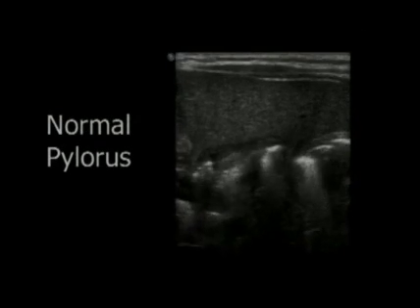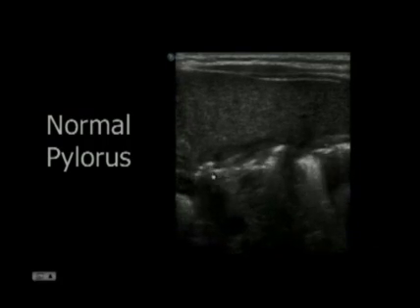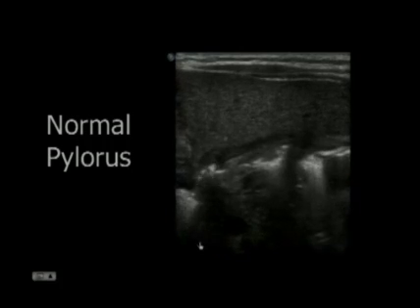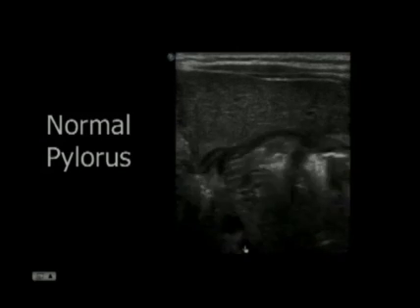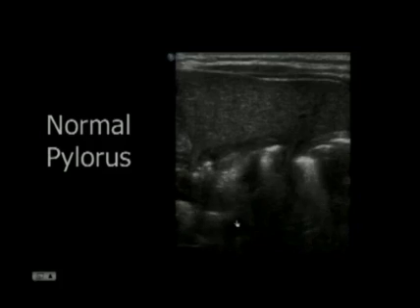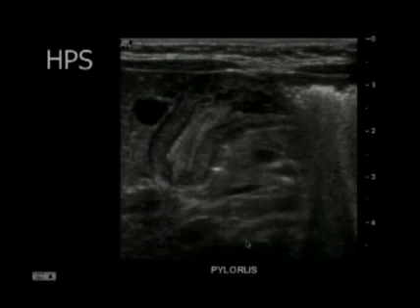At real time, when you're watching, it's easy to see fluid move through the antrum, through this narrow pylorus, in this case shooting out into the duodenal bulb. The duodenum is not dilated. This is a normal examination, and you can see the normal relationship of the superior mesenteric artery right back here where the pointer is and the superior mesenteric vein. Okay, this is a normal relationship which we'll get into with malrotation.